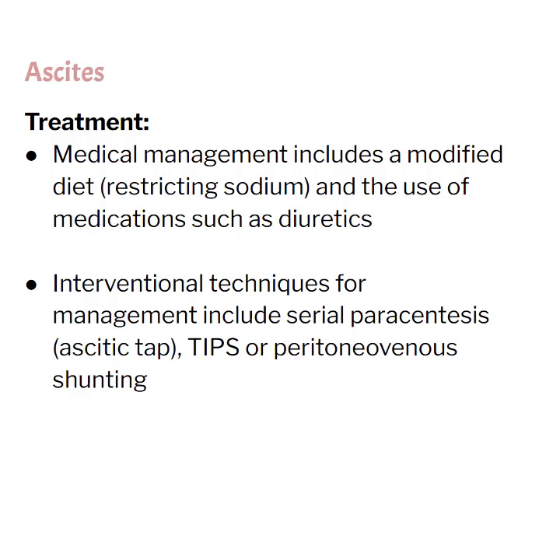When ascites has been visualized in the abdomen, it's a good idea to make sure that you're taking pictures of every quadrant showing the extent of the fluid within the peritoneum. Because it is free fluid within the body, it does pool to the most dependent area. So if you have your patient slightly sitting up, then that fluid is going to flow more down into the pelvis. If they are flat on their back, you're most likely going to get an even distribution of the fluid. If you roll them to one of their sides, then the fluid's going to float that way. So your best bet is to have them in the supine position as flat as possible so you can evaluate how that fluid is dispersed into the 4 quadrants and take pictures of them.